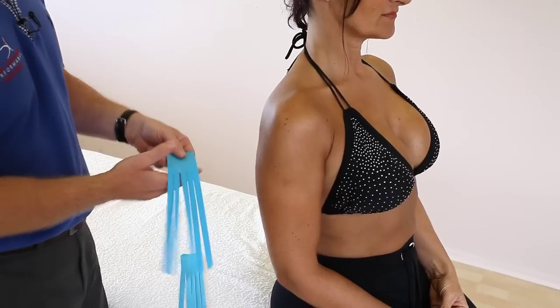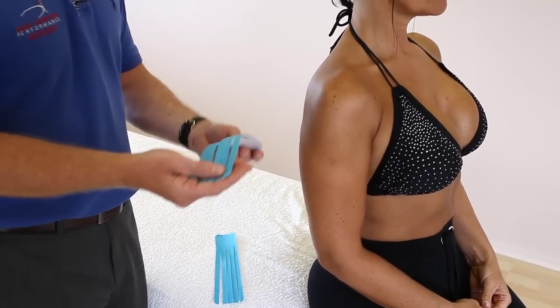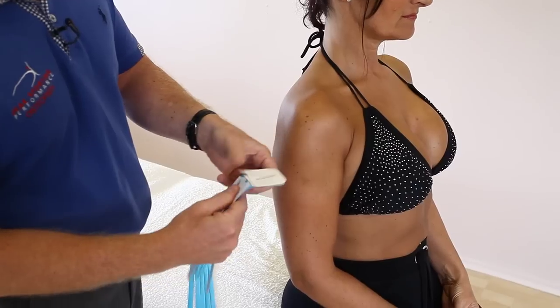So what we've got this time, we've actually prepared an I-strip cut into five fingers and I've got two of them. We're going to turn it over and separate the five individual fingers, like so.